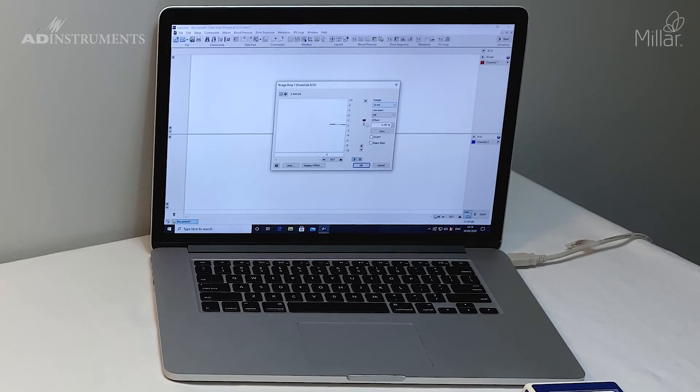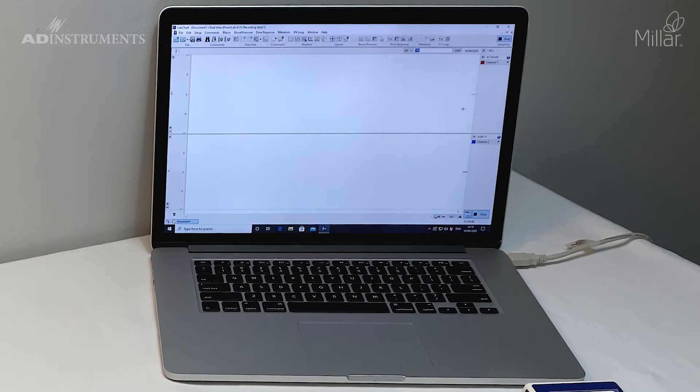My range is set to 10 millivolts. I'll click zero to zero the transducer. Now it's sitting at zero millivolts. I can click OK and start recording because this is my zero level.